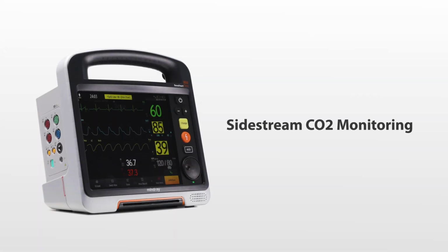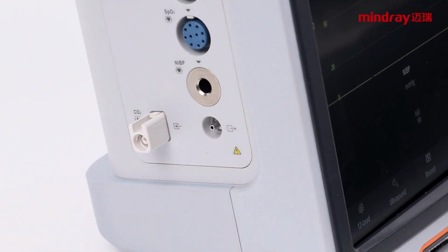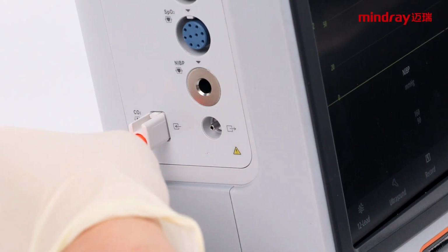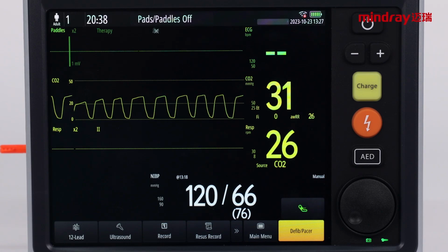Sidestream CO2 monitoring. Ensure that the CO2 adapter is inserted into the side of the defibrillator. Insert the filter line and turn it clockwise until it's fully seated. The CO2 waveform and numeric will display on the screen. As with the NIBP and SpO2, touching the CO2 waveform area will open the setup screen.